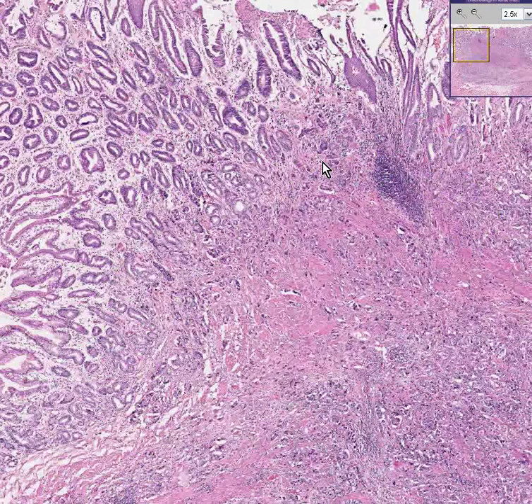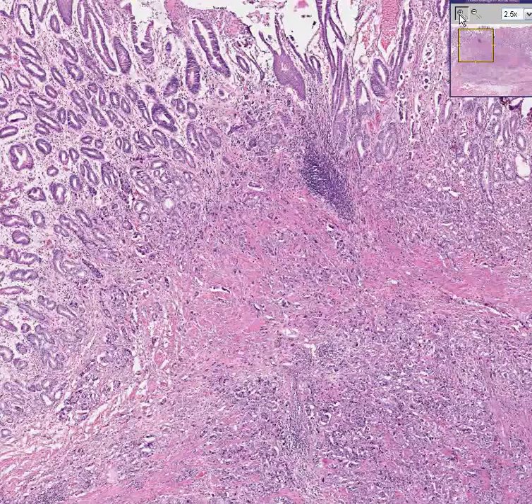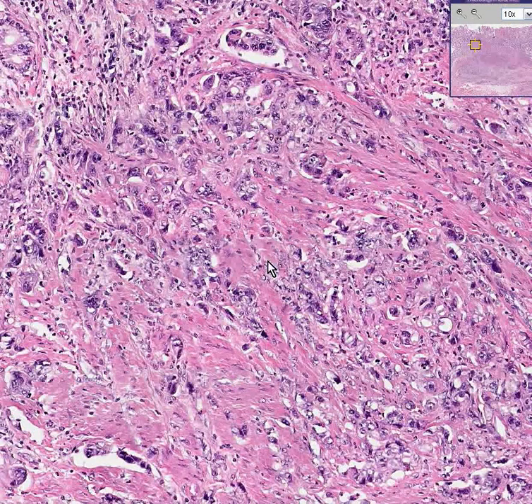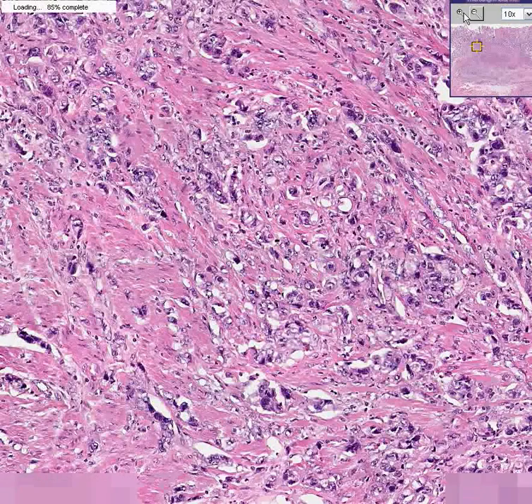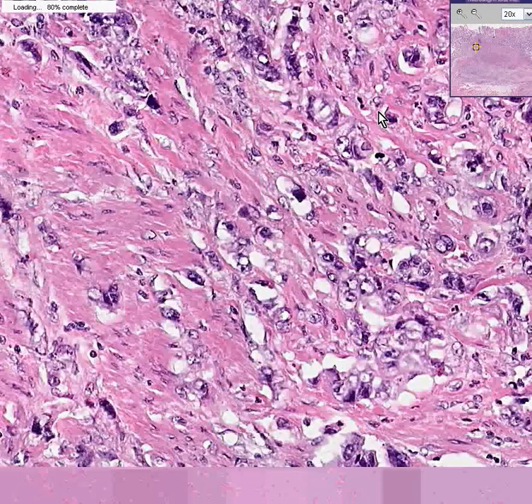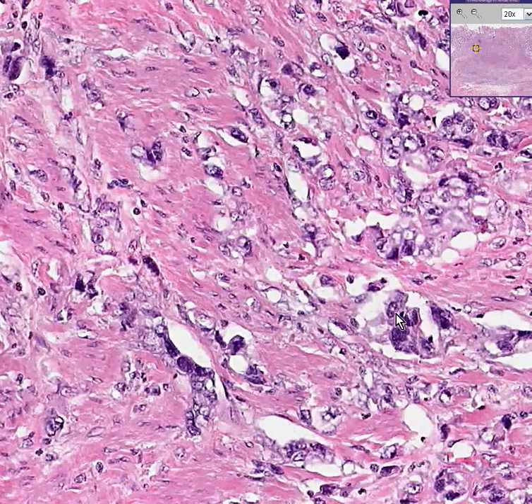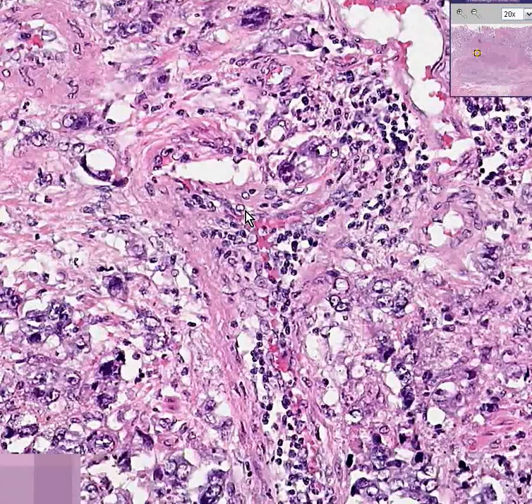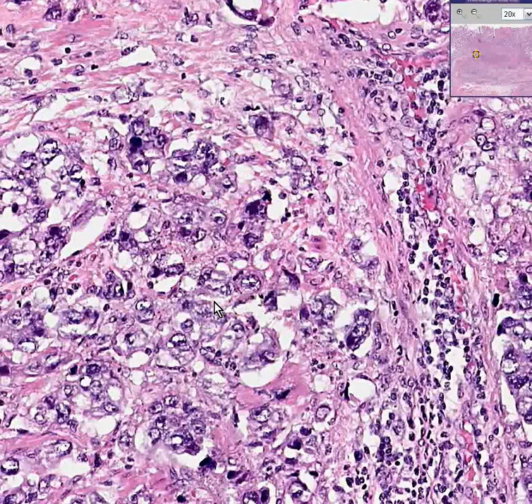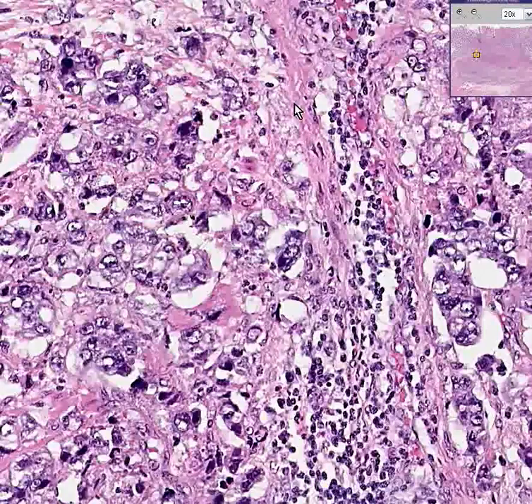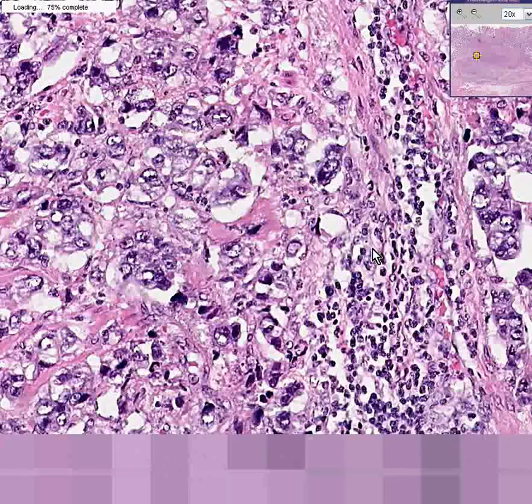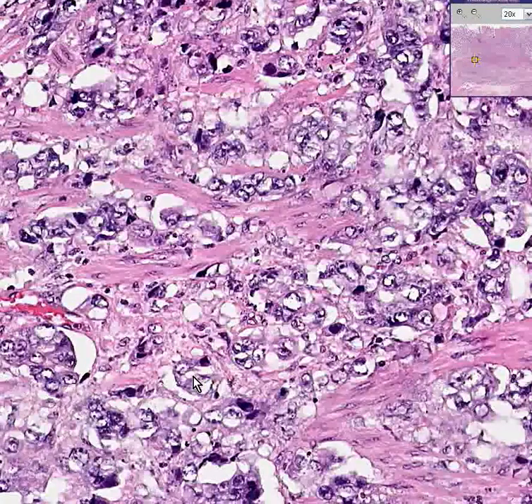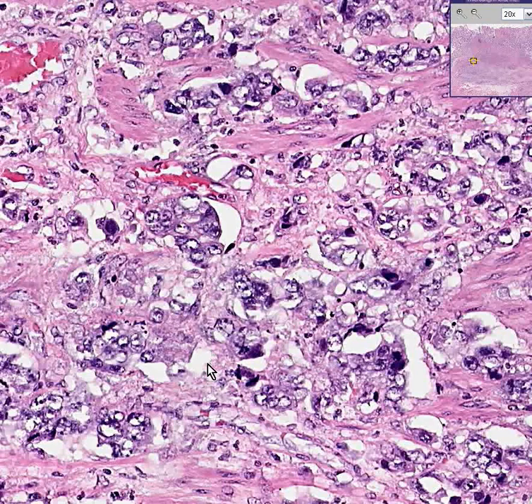As you go deeper, somewhere along the line you could see these dark, irregular, and sometimes even abortive-looking glandular structures infiltrating throughout the smooth muscle of the esophagus — sometimes occurring almost as individual cells, sometimes forming what look like little haphazard glands, or what they call abortive glandular formation. This process goes on all the way through the wall, with malignant glandular cells associated with some scattering of inflammatory cells, haphazardly infiltrating these little smooth muscle bundles.